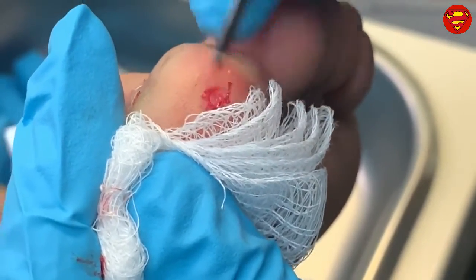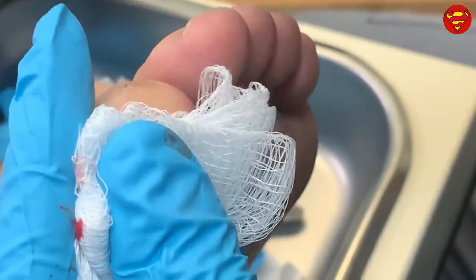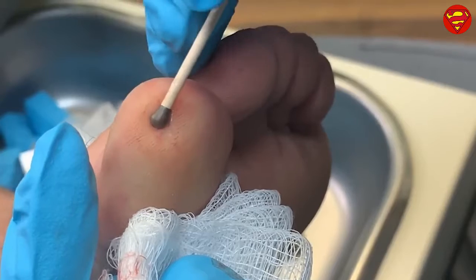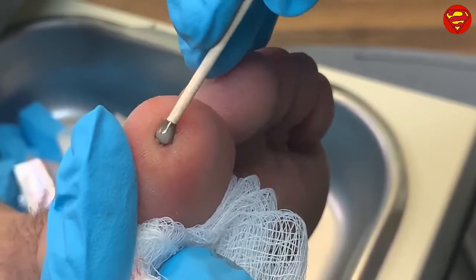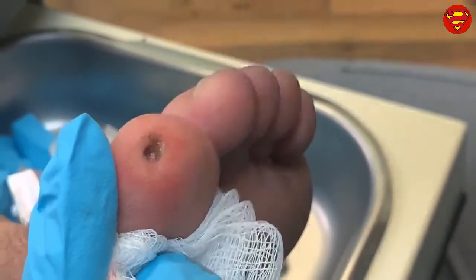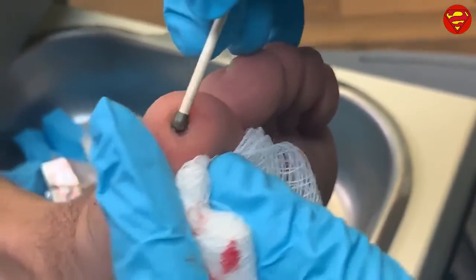All right, we're doing pretty good. So now the burning begins. And then we're going to put a little dressing on it. So now we're doing damage again. We did the damage of cutting out the lesion, and now we're burning it. There. And that was what I do for warts when I cut them out.